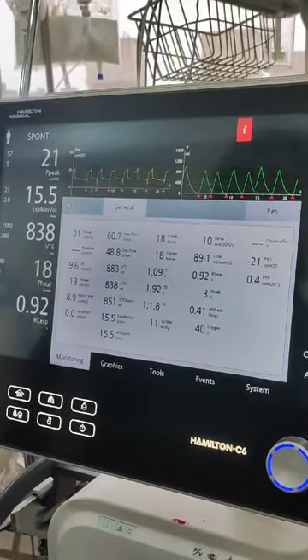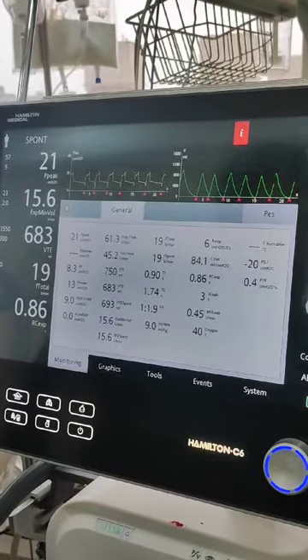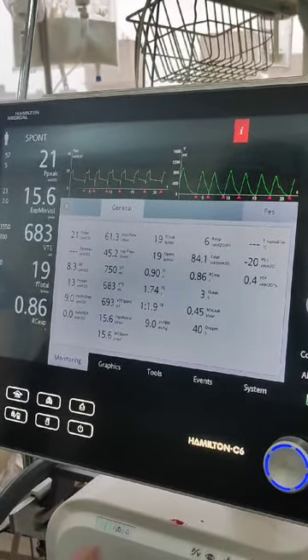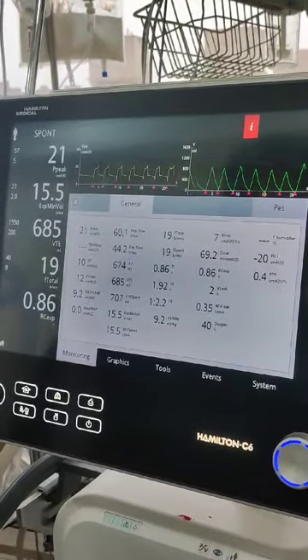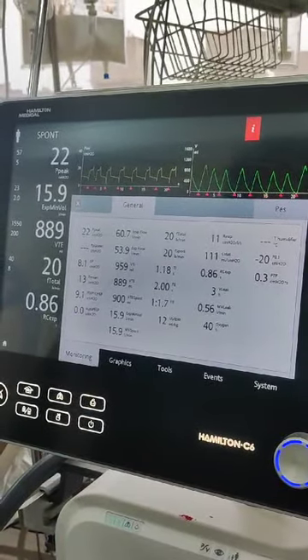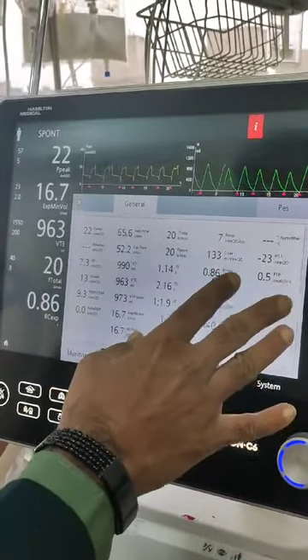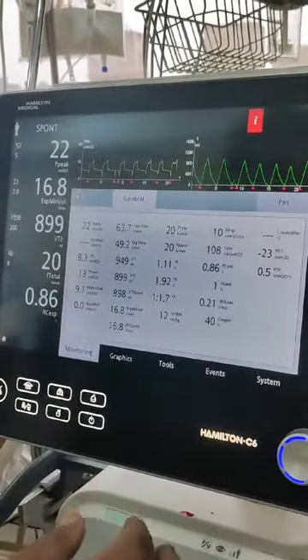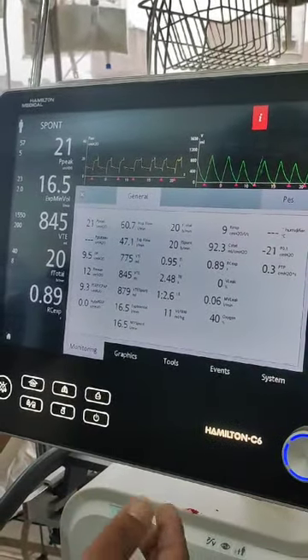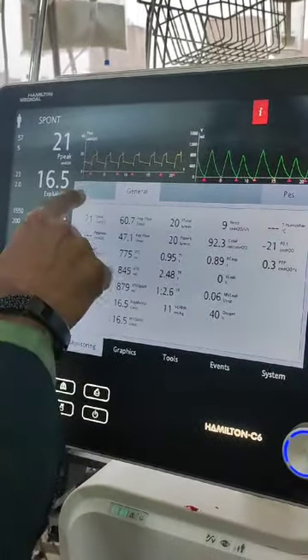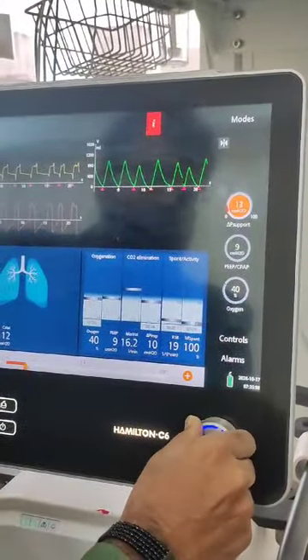I don't presume this patient has a high respiratory drive because I've ensured the metabolism is controlled — calcium is okay, potassiums are okay, and the patient is awake. But what this basically means is this might injure the lung, so I need to get the P0.1 back to normal. How do I do this? Let me try over-assisting this patient a little bit — let me go back and increase the pressure support and see what happens.